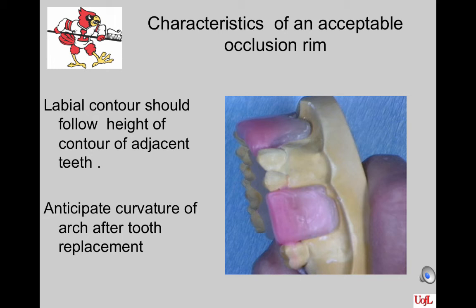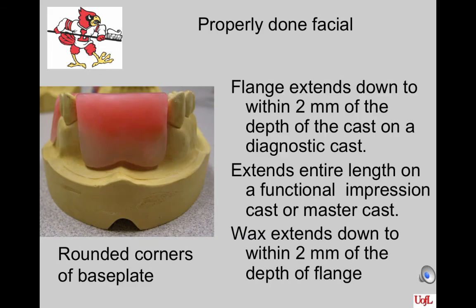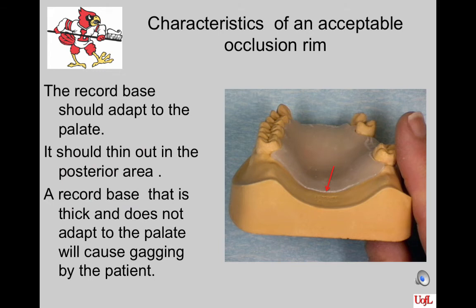Here's a properly done facial area on the record base. Notice that the corners of the base plate are rounded, that the flange extends down to within two millimeters of the depth of the cast on the diagnostic cast. If this were a master cast, it should extend all the way to the depth of the vestibule. The wax also extends to within two millimeters of the depth of the flange. The record base should adapt well to the palate and should be thinned out in the posterior area to become confluent with the palate. A record base that is thick and has a ledge across the back will elicit the gag reflex of the patient.